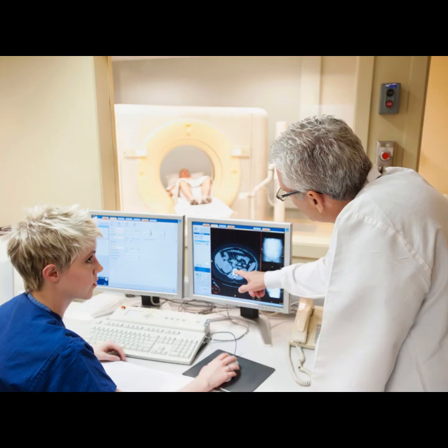But beyond just the efficiency of the path, we can also utilize simple numeric correction. We don't necessarily need a physical pulse to correct for decay. We can simply log the precise time of acquisition t for every single data point read by the receiver. Then we can digitally recover the true signal value using that formula, Q of k equals Q of k times exp of R2 times t. We're mathematically boosting the faint signal back to where it theoretically should have been.